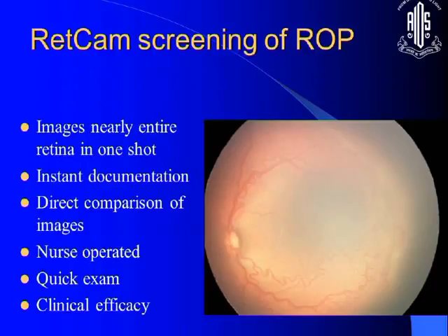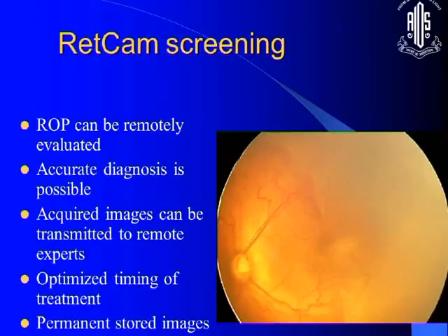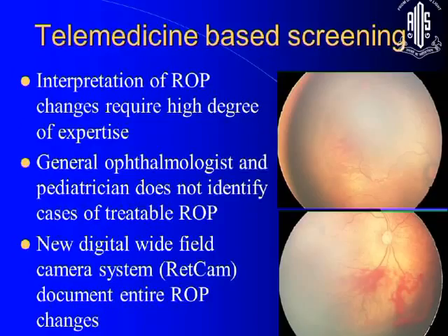It will give you instant documentation. As I already said, it's a very quick exam, although it's a contact method, and you can remotely send the image and get it diagnosed by an expert. So that's the best thing. You can permanently store these images. So I think a lot of things are possible.